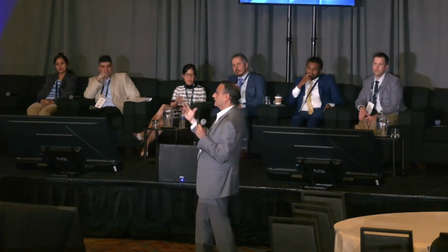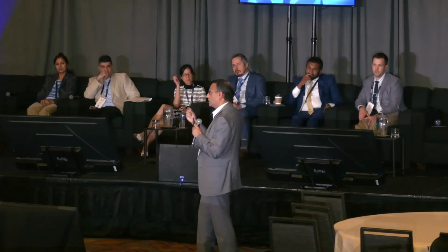Now, in terms of the gradient, Matsubara from Japan is the one who pioneered this technique. We started this in Brigham first in 2000, and there was 61% reperfusion pulmonary edema because they were using nominal sized balloons. What Matsubara found was that if we use small sized balloons first, get the pressures down, and then use optimal sized balloons in future sessions, that is what made this balloon angioplasty safe.